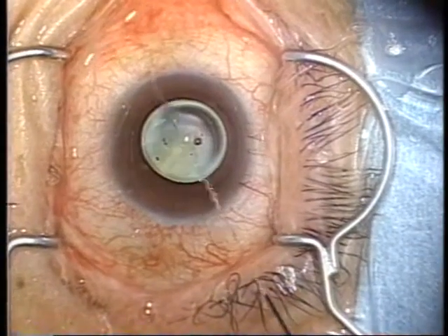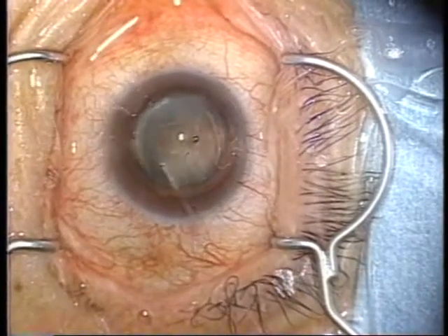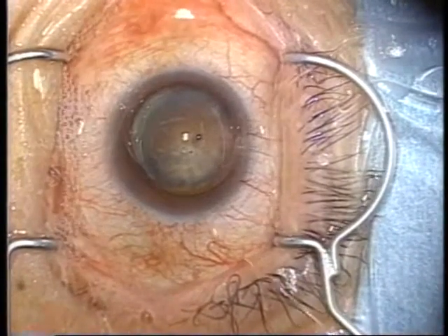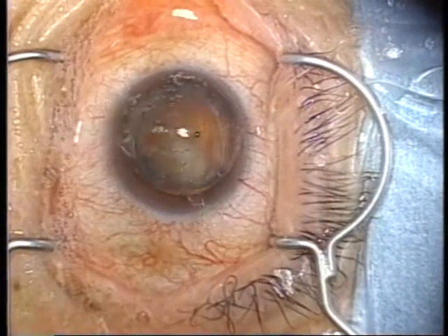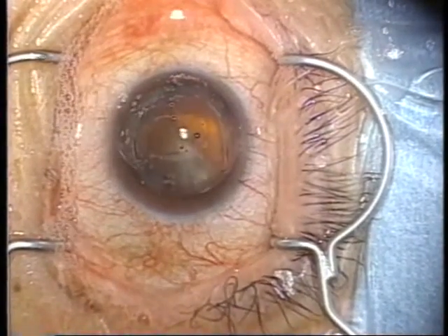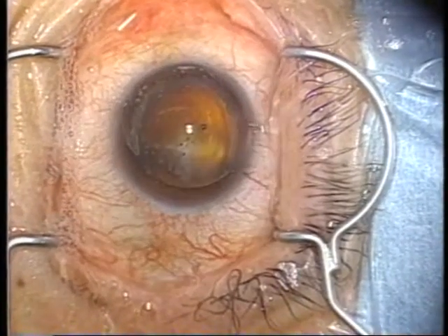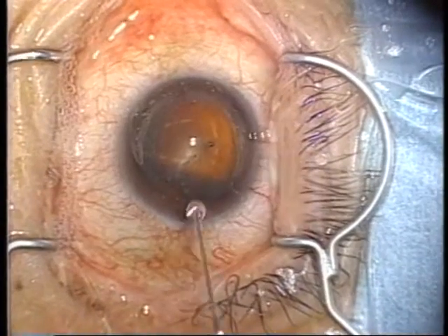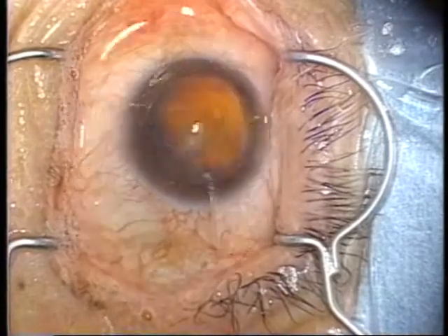As a precaution for the wet shell technique, perfusate should not be strongly applied to the surface of the viscote layer as is usually done. The part to which perfusate has been applied would be depressed and the viscote layer would become non-uniform. As a result, the visibility would deteriorate or air bubbles would be caught in the viscote layer, and once caught, they would not easily leave the viscote layer.